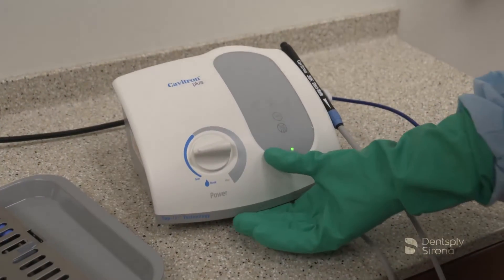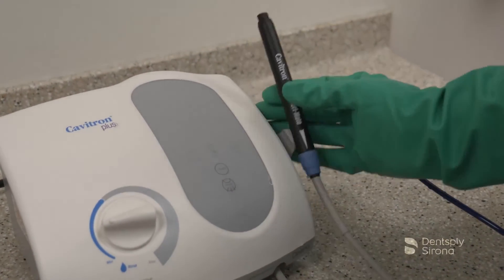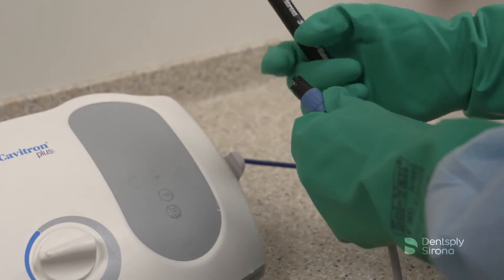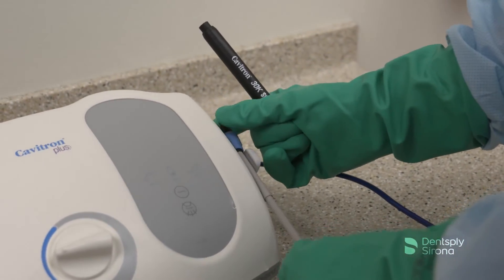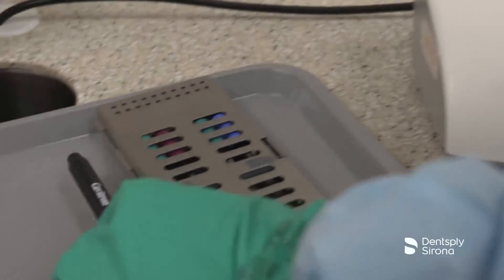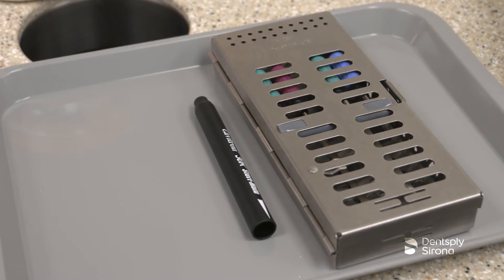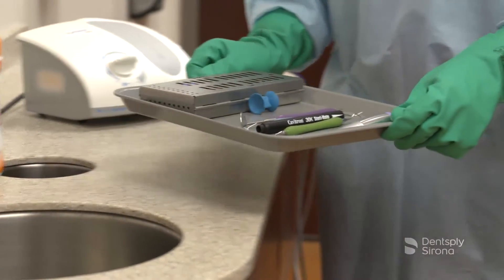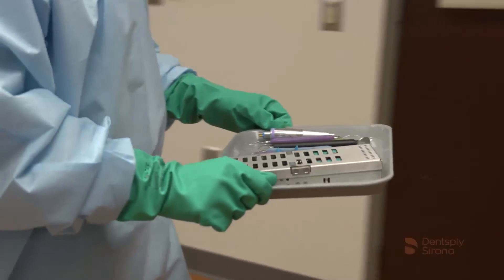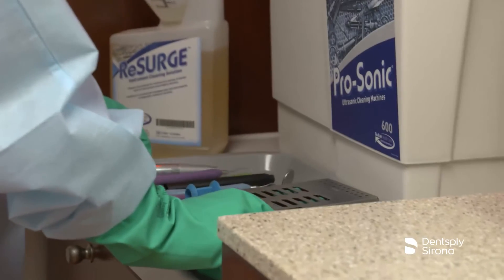After the purge cycle is complete, turn the system to the off position. Remove the SteriMate handpiece from the unit. Contaminated instruments should be transported in instrument cassettes, trays with sides, or labeled containers with lids when cassettes are not an option. Occupational safety must be followed by clinicians to reduce the risk of sharps injuries and exposure to contaminated instruments.